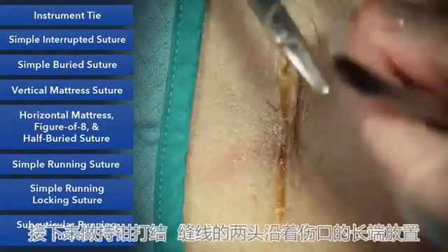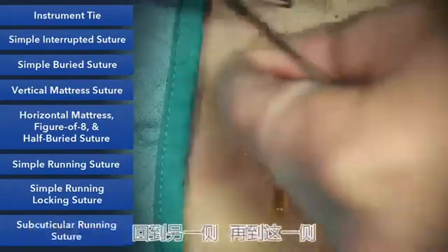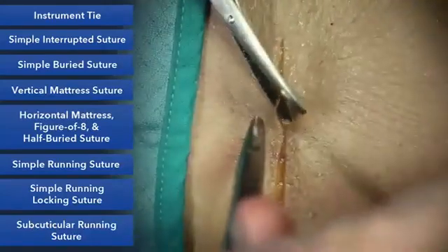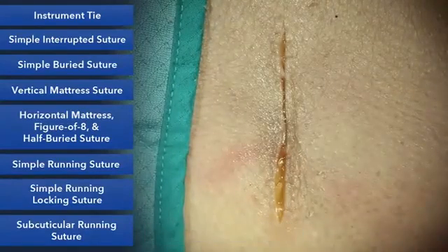And we'll do our instrument tie, and we'll pull it along the length of the wound so it'll allow it to bury. Come back to the other side, and back to the other side. And that is our simple interrupted buried suture.